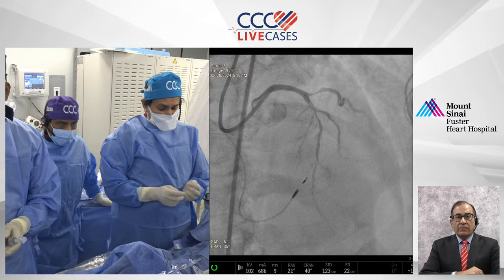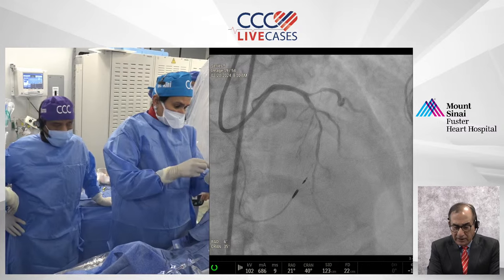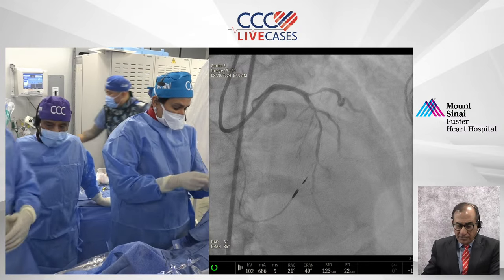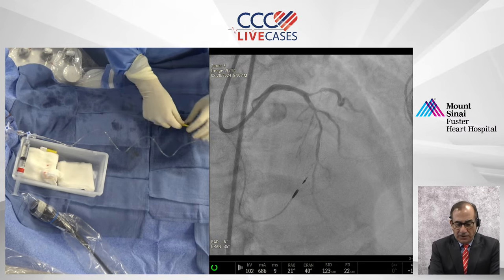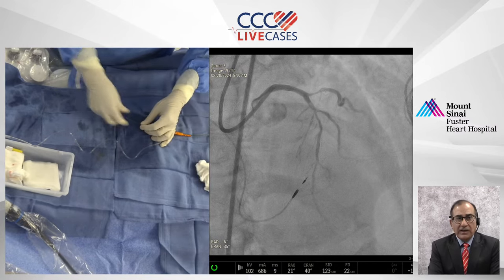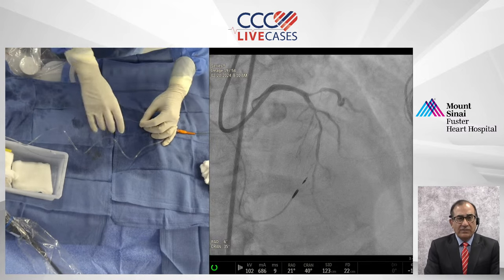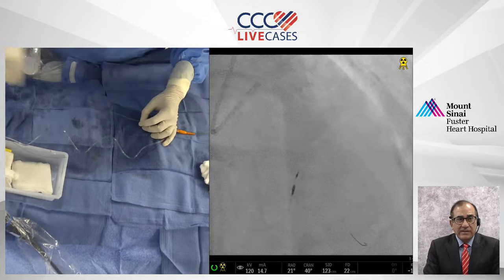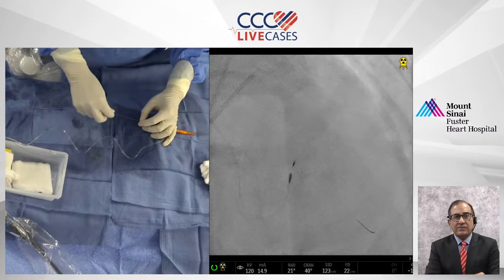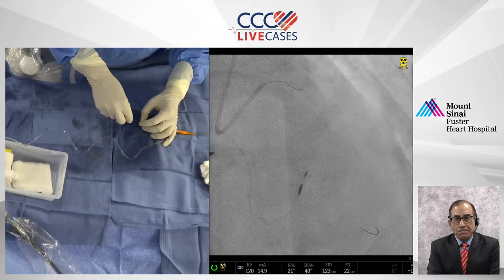High pressure. Welcoming several people internationally, including audience from India and Egypt. Sameen, two questions for you as we proceed with this strategy. First of all, how commonly are you seeing such cases where you have a negative SPECT MPI and significant coronary artery disease? I would say that at least in about 20%.